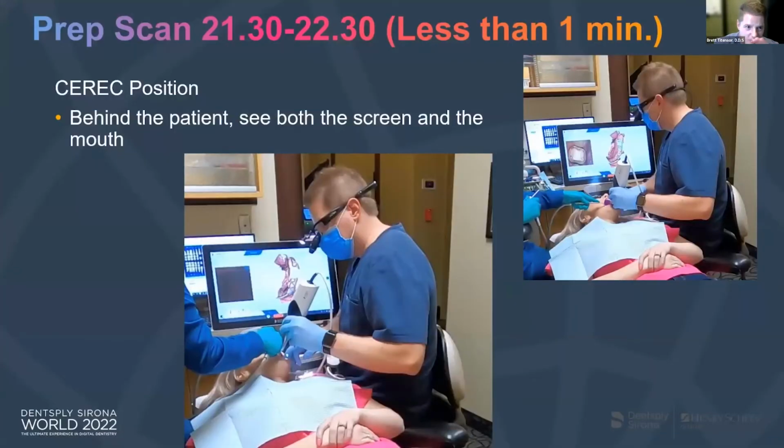All right, so we've prepared the tooth. Now we're going to scan the prep. This, I put less than 1 minute, all right? So if the assistant came in and cut that tooth out, this should be almost like a 15-second scan.